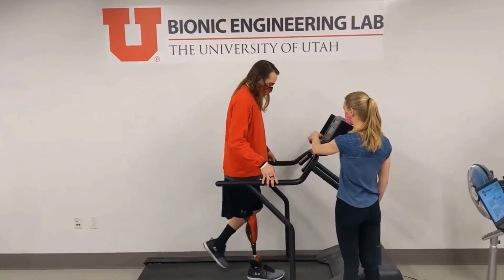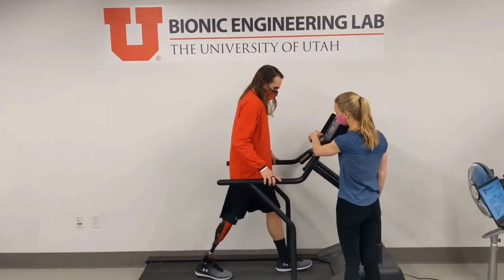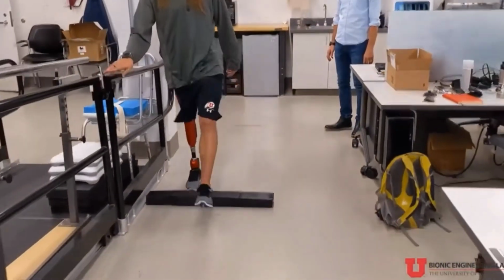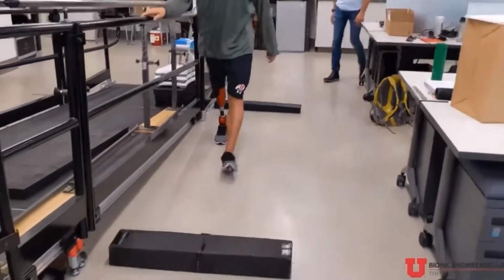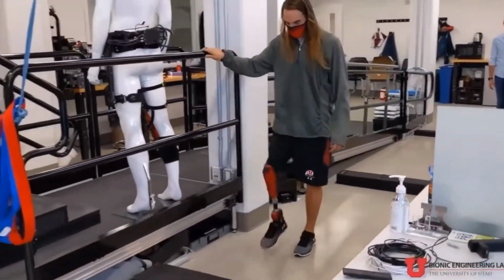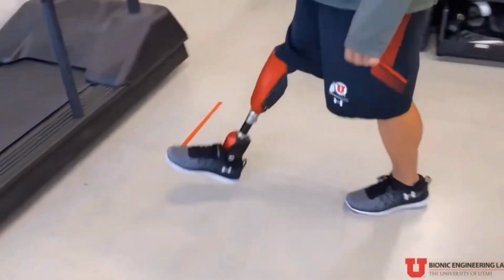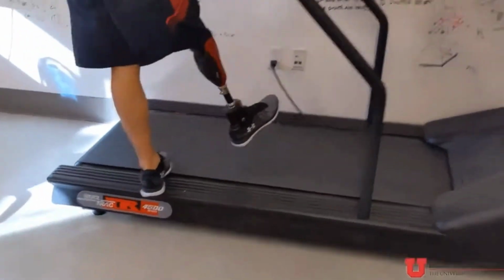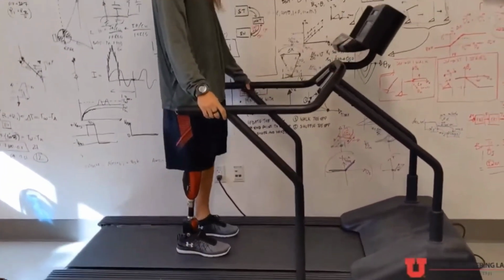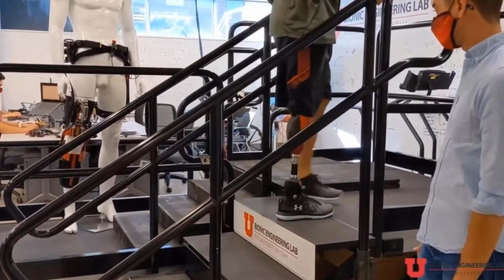The Utah Bionic Leg will enable amputees, especially the elderly, to walk over longer distances and gain new levels of mobility. The team's leader, Dr. Lenzi, set 2 goals. First, he wanted to design a prosthetic that is lighter and more powerful than a real human leg. Secondly, create a leg that is self-aware and can move naturally in any circumstance.